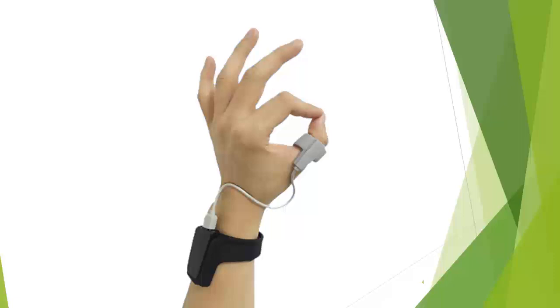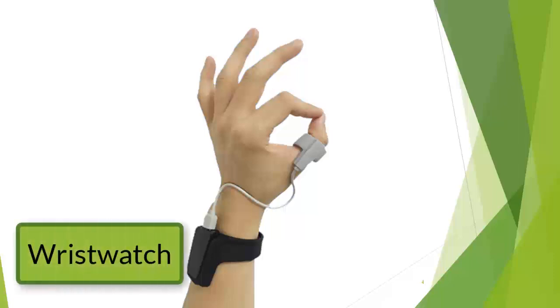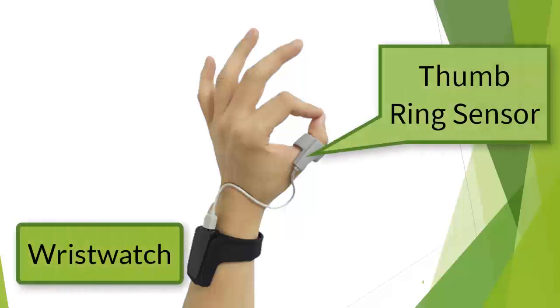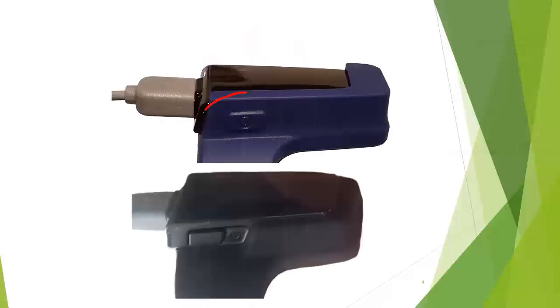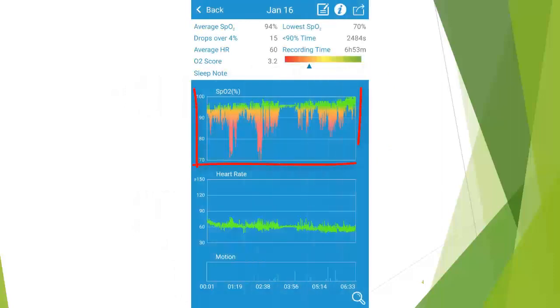Your prescriber has ordered a home test using the Checkme wristwatch. This is a simple test which you perform in the comfort of your own bedroom and only requires you to wear a comfortable thumb ring sensor and is initiated with a single button push on the wristwatch. This test measures oxygen levels during your sleep. Low oxygen levels are symptoms of sleep apnea, a potentially serious medical condition.